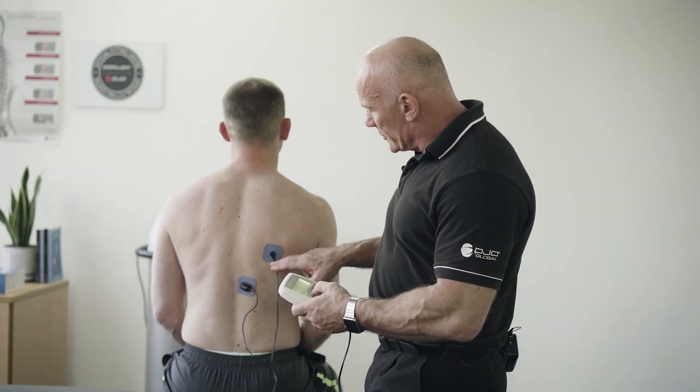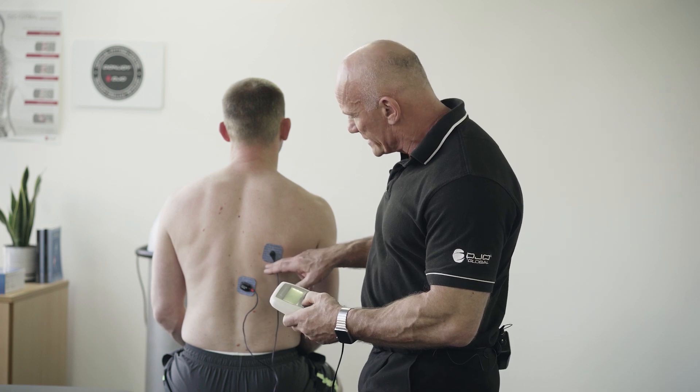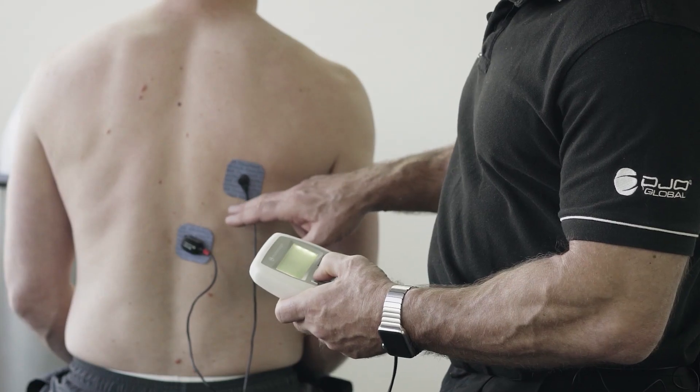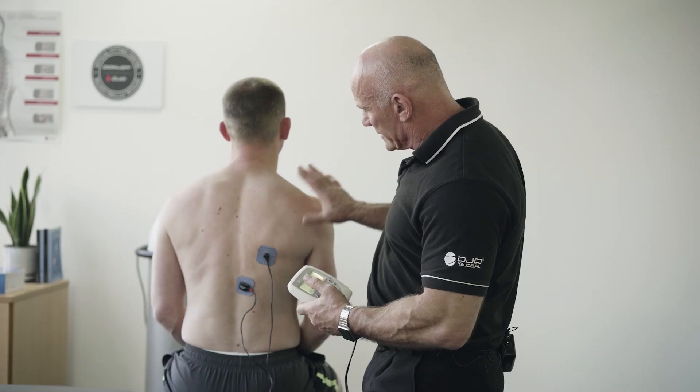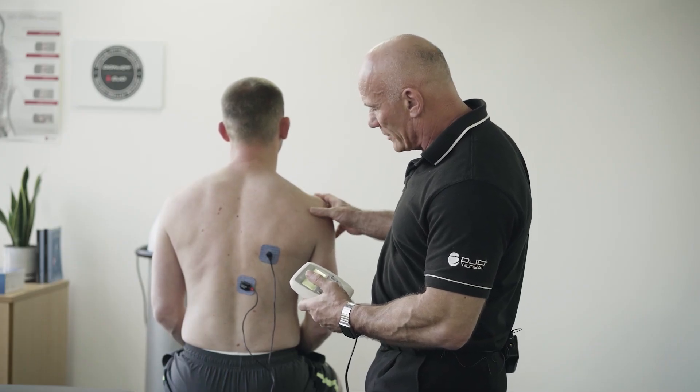What I want to show you now is that using a small amount of intensity I can get the lower trapezius muscles to fire and get the scapular position in place.